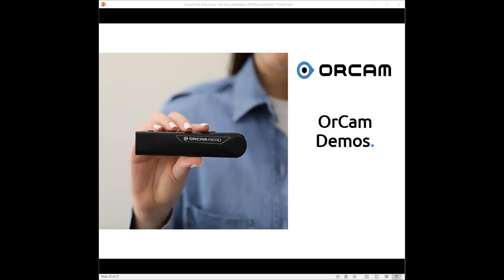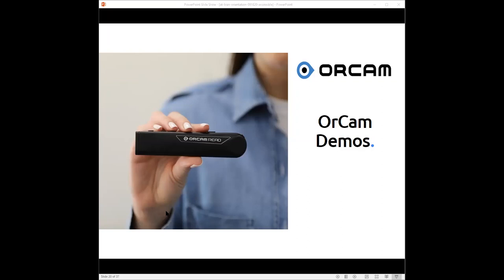Now we're going to show how OrCam Read works. Those who can see should be able to see me on their screen now. This is OrCam Read. I'm holding it in my hands and bringing it closer to my computer camera. It's very tactile. On the top edge, there is a charging port at the back.